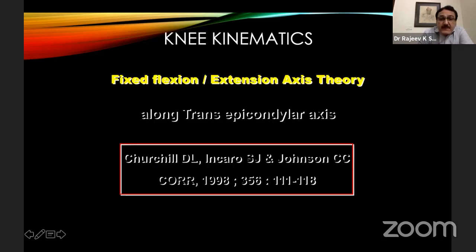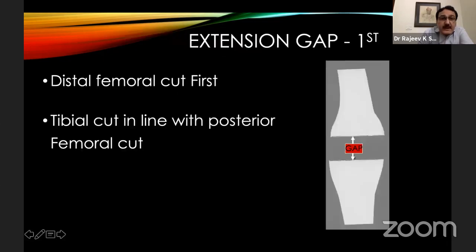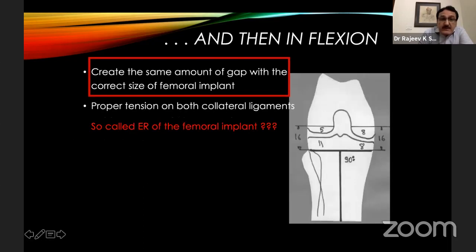We followed the knee kinematic theory, the soft tissue balancing to allow the knee in flexion and extension. First, the balancing was done in extension and then in flexion. Distal femoral cut first. We used the help of computer-assisted surgery in 2006. The tibial cut was in line with the posterior femoral cut because that was the most difficult aspect, how to make a tibial cut in this situation where you have a high tibial osteotomy with such significant deformity. We created the gap between the femur and tibia. We rightly rotated the femur, the right amount of external rotation and proper tension on both collateral ligaments.